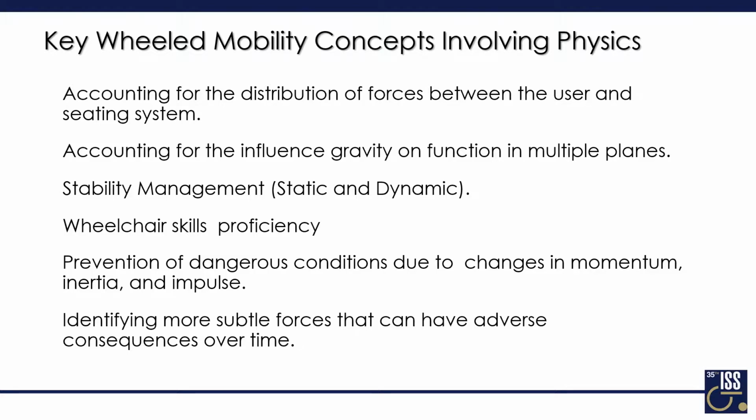Stability management, so looking at how the device works in different environments, and is it going to be able to be used without any risks of tips or falls, because those can result in injuries or worse.